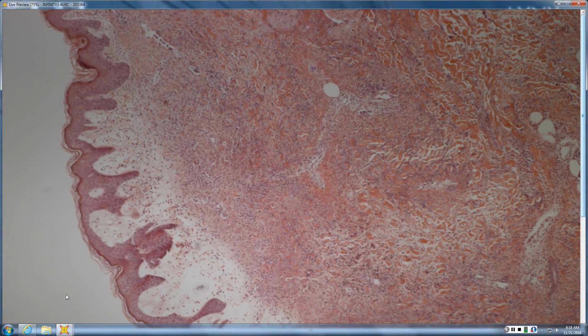Whereas this amount of papillary dermal edema, and these are all neutrophils with karyorrhexis. I thought it was Sweet's. So Sweet's, absolutely. This is a Sweet's pattern. So nodular and diffuse infiltrative polys, karyorectic debris, massive papillary dermal edema, classic Sweet's.